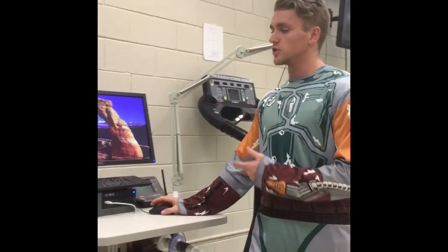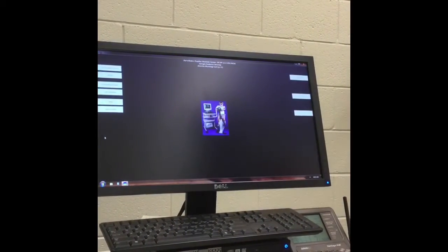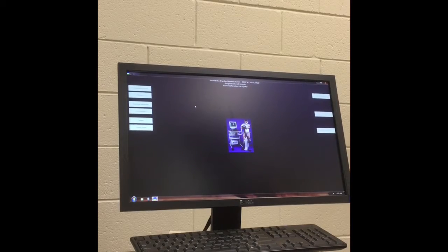Next, click the icon called True One on the screen. Once you have gone through the process and waited 20 minutes, the next step is to click on the gas calibration tab.